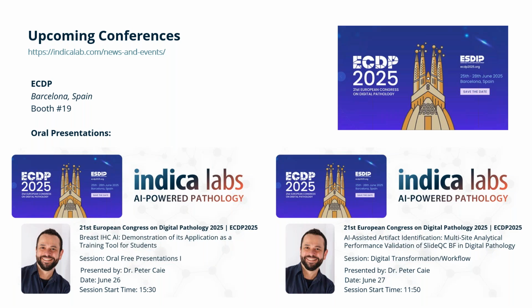Next question, Ghislaine, is asking about the blood vessel and autofluorescence detection step. Asking for that classifier, were you training on all channels or only on specific channels?